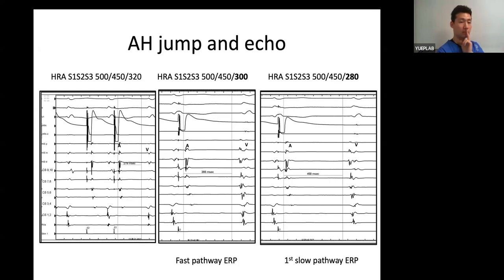Okay, that's a requirement. Second is that if indeed we say that this is a rightward extension changing to a leftward extension, your CS needs to be more eccentric. Second jump, that's a criterion. You don't have that here, right? That's why I argue probably coupling-dependent junction escape rate. That's to explain why he said earlier the CS EGM didn't change at all.